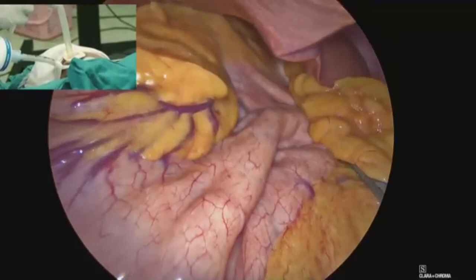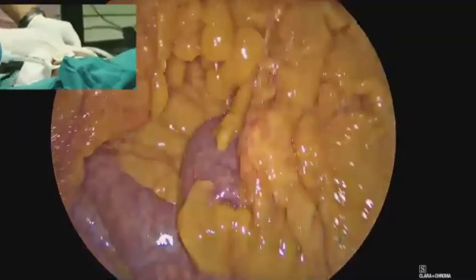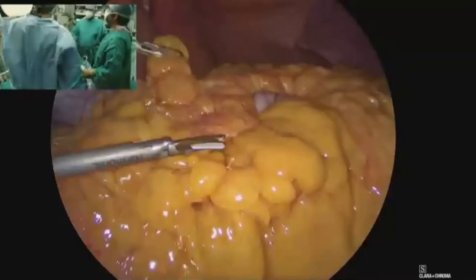So that's it. Take it out. The fluid is evacuated. We have this nice stomach here. I can easily perform the endoscopy. And so is the situation of the bowel. Let me just show you the bowel. It's fine. It does not create problems in pneumoperitoneum or the space for us to do any procedure. Now let me start the procedure. It's going to be a short procedure because we're just going to do a one anastomosis.